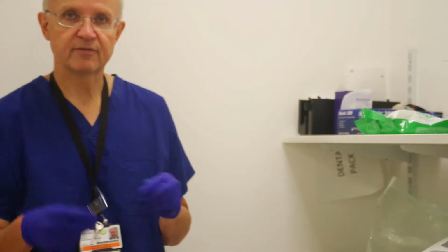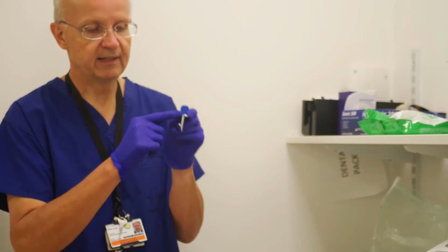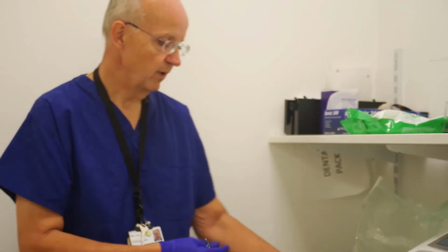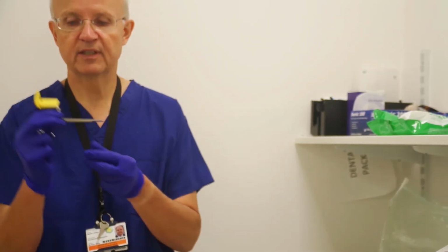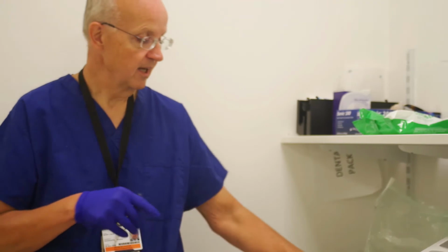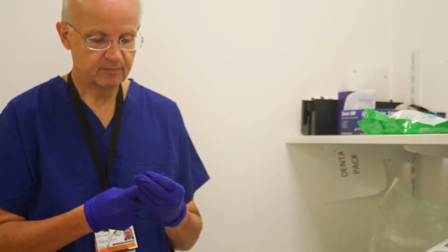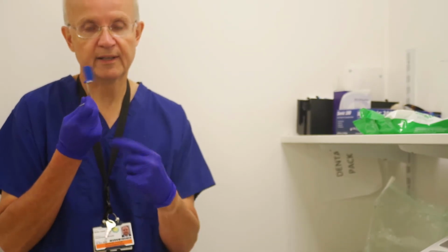The other thing that is different is that the little bar comes away and down from the holder, whereas for the posterior one it comes out to the side. And again, if you think about this, if you put that in the mouth, that comes out towards the front, as Carlin was saying, whereas this one, when you place it into the mouth, and we'll show you this in the dummy in a minute, that's going to come down and away.